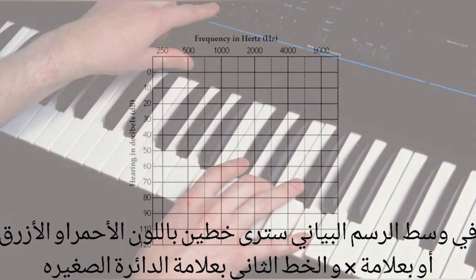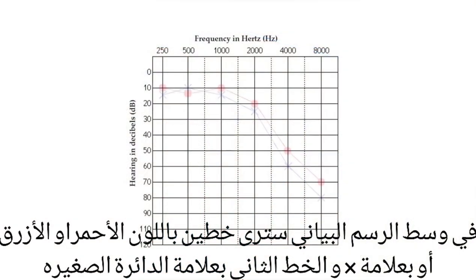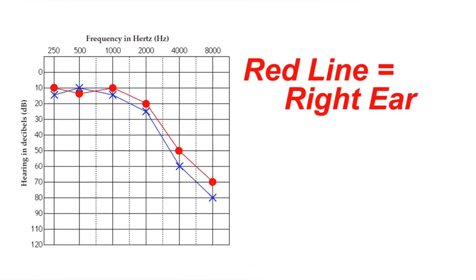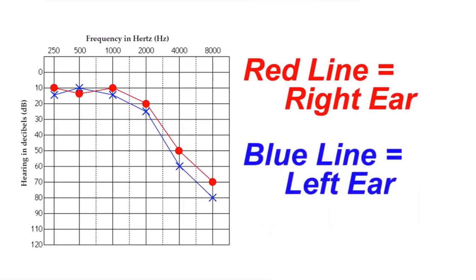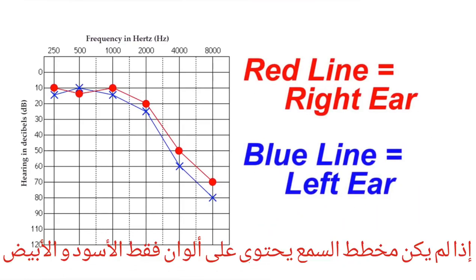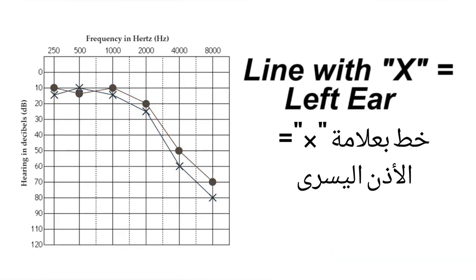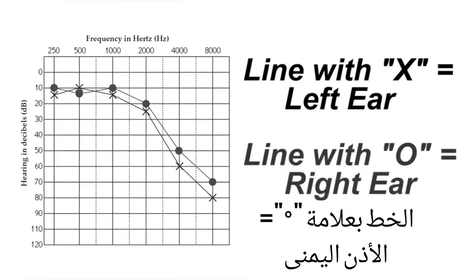This is just like a piano keyboard that has the lowest frequencies on the left and the highest frequencies on the right. On a typical audiogram, you will also see two lines, one red and one blue. The red line represents the hearing in your right ear, and the blue line represents your left ear. If your audiogram does not have colors, then the line with the X's represent your left ear, and the line with the circles represent your right ear.